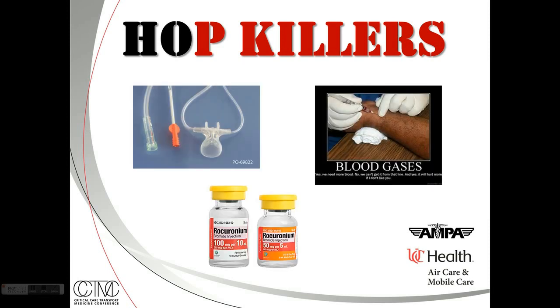And again, the end-tidal CO2 is something we're going to need to watch like a hawk. Capnography, until we can get a blood gas, is the key to making sure we keep this patient alive and avoid peri-intubation morbidity or mortality or cardiac arrest. We've got to keep that end-tidal CO2 low where it is until we can get a blood gas. And if at all possible, we want to avoid reparalyzing these patients after the initial RSI because it can be very beneficial to them to regain the ability to breathe and control their minute ventilation. Their brain knows where they need to be to maintain their pH at a safe level. So avoid paralysis if at all possible.